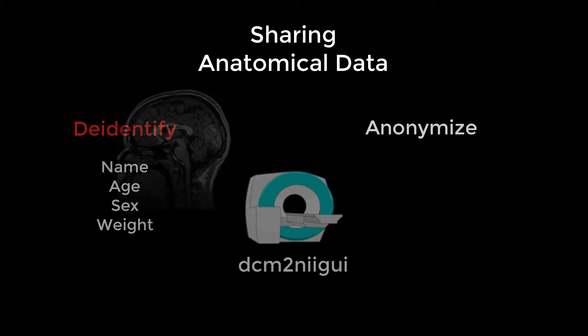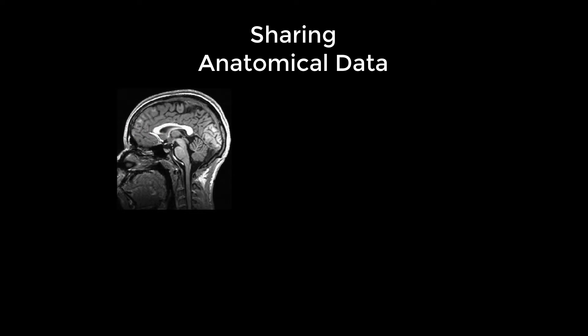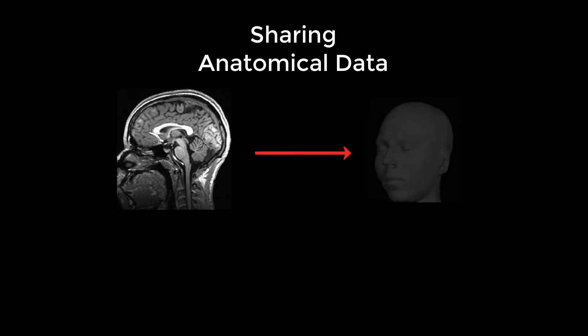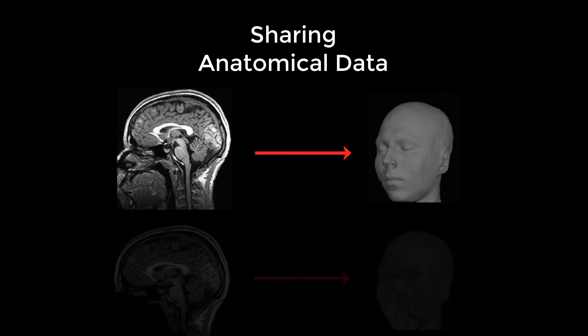However, anatomical images can still be reconstructed to create an identifiable face. This tutorial will show you how to remove the face from your anatomical scans.